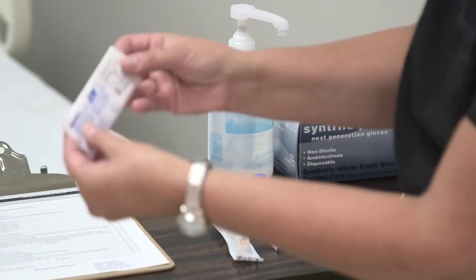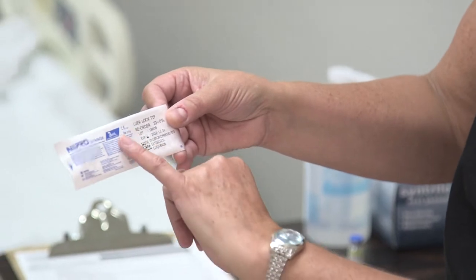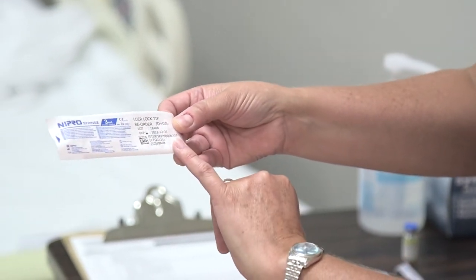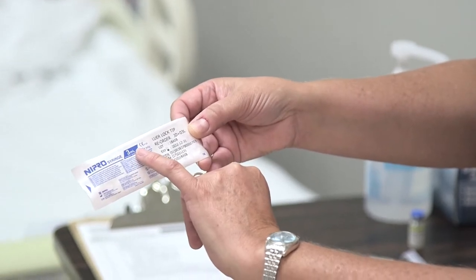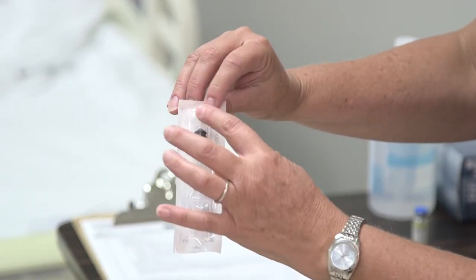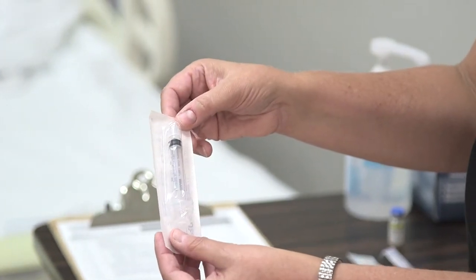So first I have to pick out the right syringe. As you can see here, we have a 3 ml syringe. And if you can find on here, it tells you right there that it's a 3 ml. It doesn't have a needle on it, which is fine because we want to make sure we have the right needle for doing an IM injection.